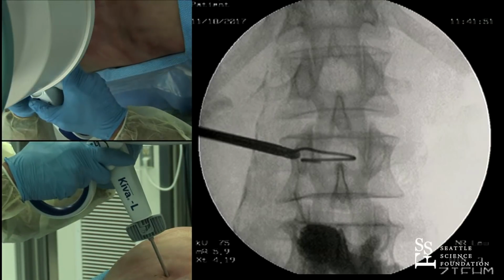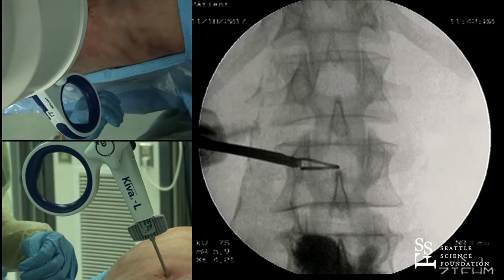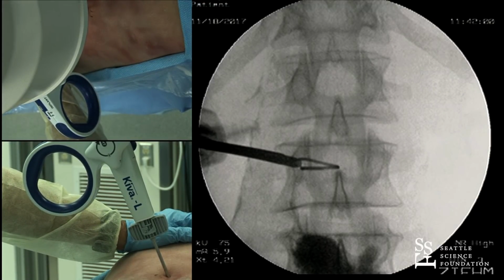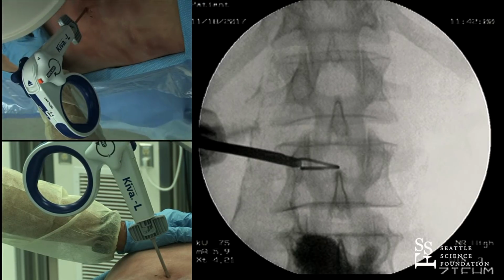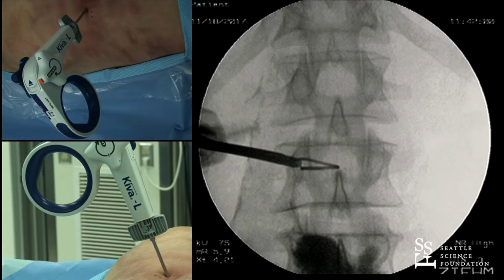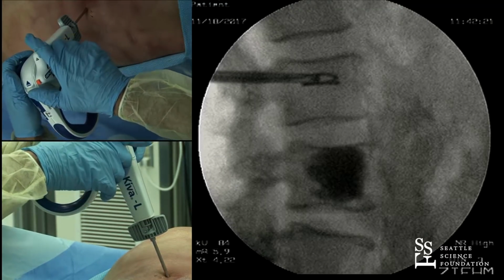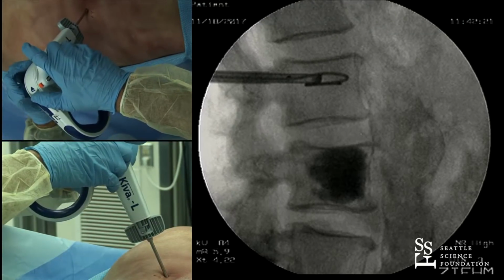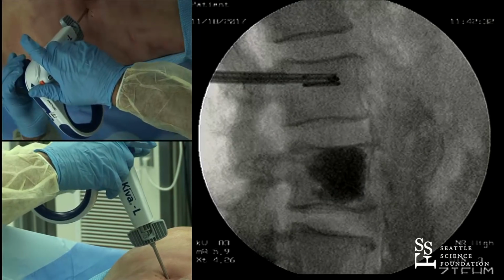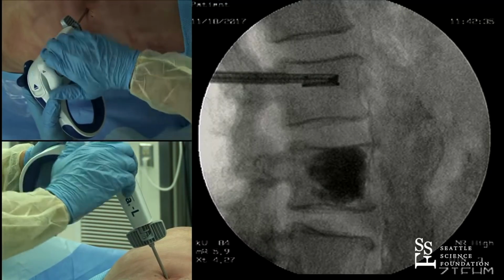So what I'm going to do is turn it back, and I'm going to work this in conjunction with the implant. So let's go back lateral. And what we're going to do is put some of the coil out, and put some of the implant out, and we're going to use the implant to bolster the strength of the coil. So we have the coil nicely deployed, and we're starting to get a little buckling. So I'm going to bring it back. As I mentioned, once the implant goes out, it doesn't come back. So I'll deploy it by pressing the orange button.